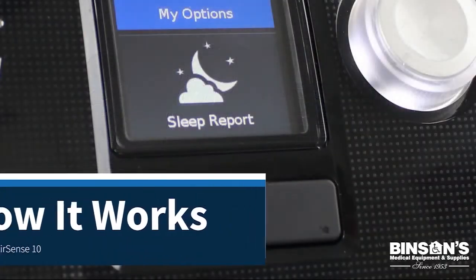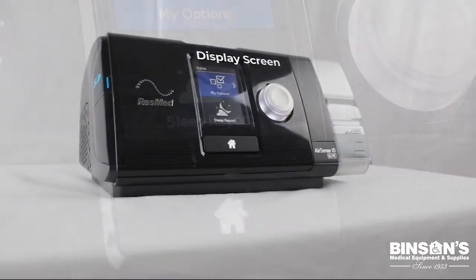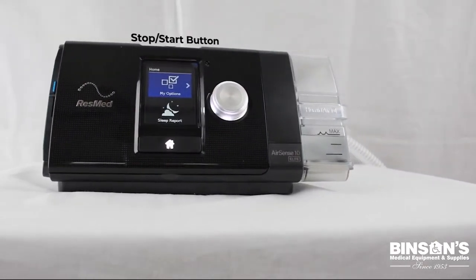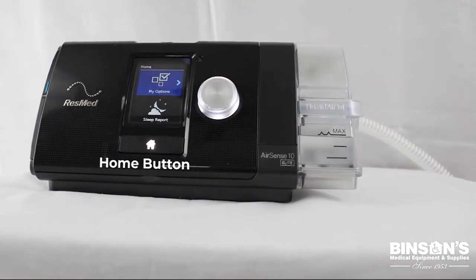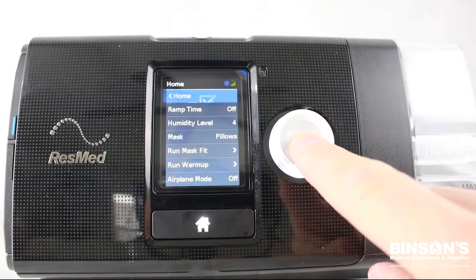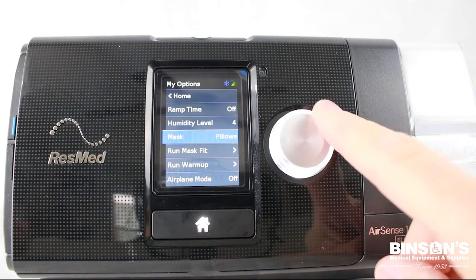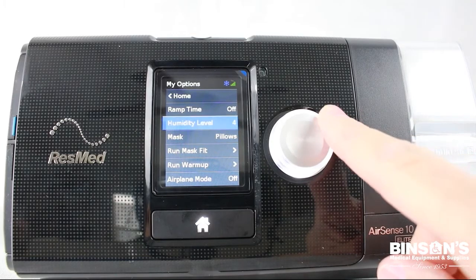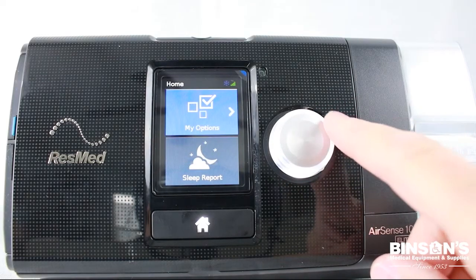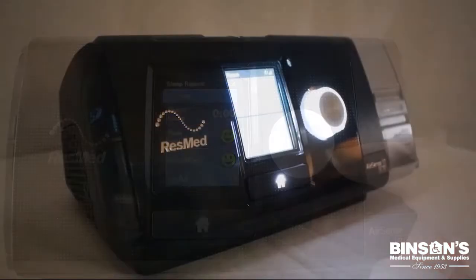Let's get to know your device a little better. You will notice your machine has a display screen, a navigation dial, a start-stop button, and a home button. Starting with the display screen, selecting My Options will allow you to view and customize your comfort settings. A summary of your last therapy session can be viewed as soon as you push stop by selecting Sleep Report.